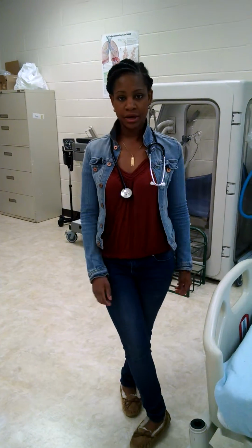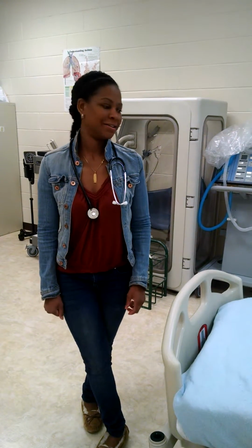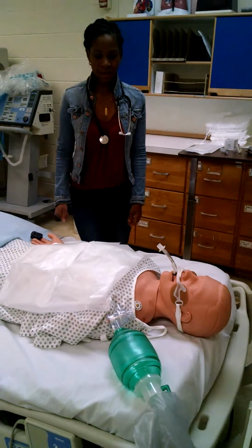Okay, so I went over the patient's chart for any significant findings, data, and history. This patient has rhonchi. We know this through assessment and auscultation. So today, as indicated, I'm going to be performing suction via the oral airway with an open suction catheter system. And the patient has already been intubated.